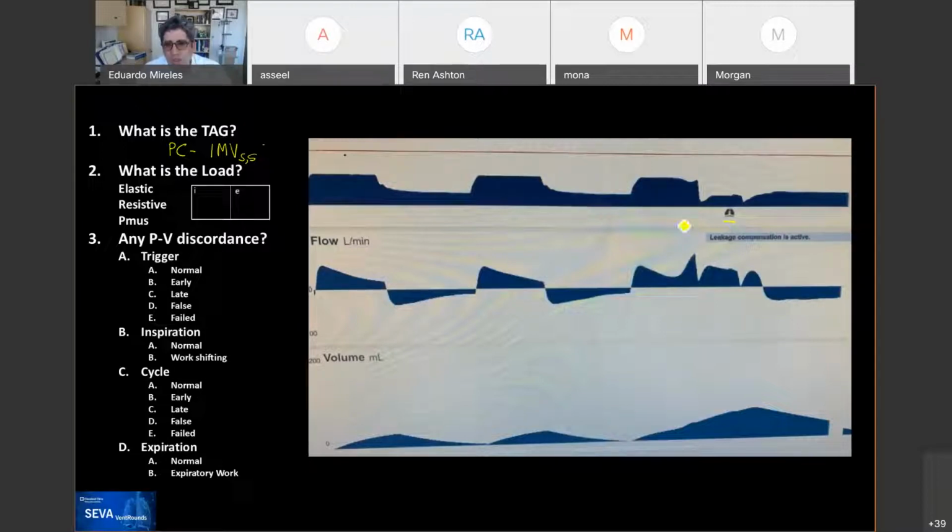And we'll talk about why there was no pressure during these breaths. The pressure support was set as 0 for the spontaneous breath. So this patient did not get any extra support as he was trying to trigger an extra breath here. So this is a mandatory breath, a mandatory breath, a mandatory breath, and then there's a spontaneous activity here, and then there's another spontaneous breath over here.